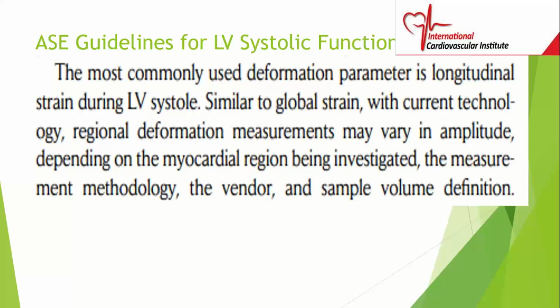So we stress that the most commonly used deformation parameter is the longitudinal strain, and this is enjoying tremendous popularity and tremendous clinical utility. It's very useful. So you need to fully understand strain.